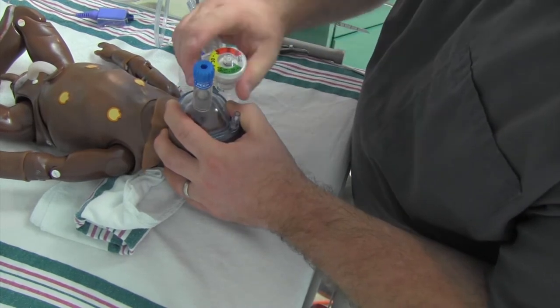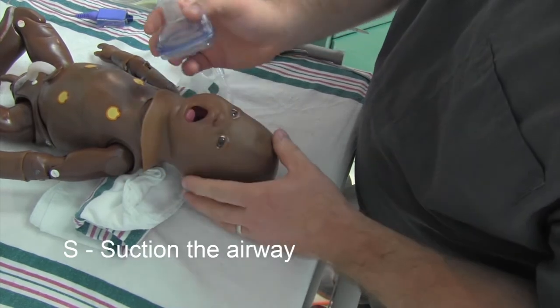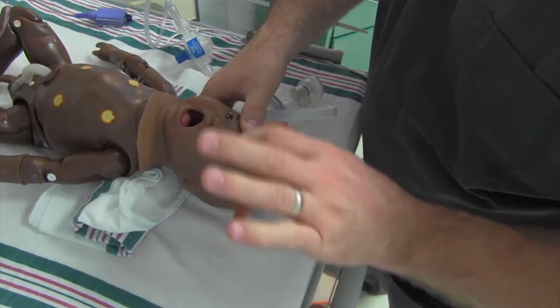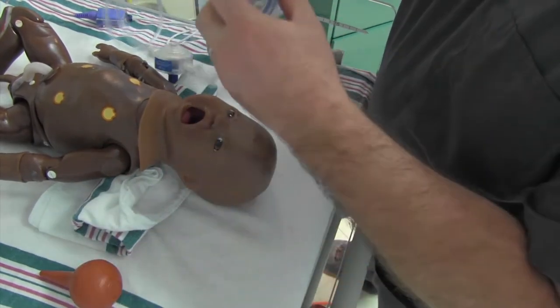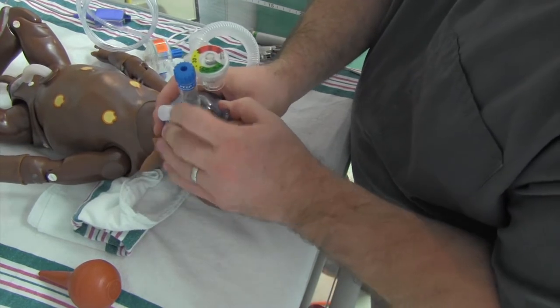Then I try to ventilate - not getting anything there. The next one is S - that's suction. So now I can suction the kid, do a little bit of suctioning. Don't want to go too deep because you'll cause a vasovagal response. See if you can get anything out. Try to get a good seal and give a breath.